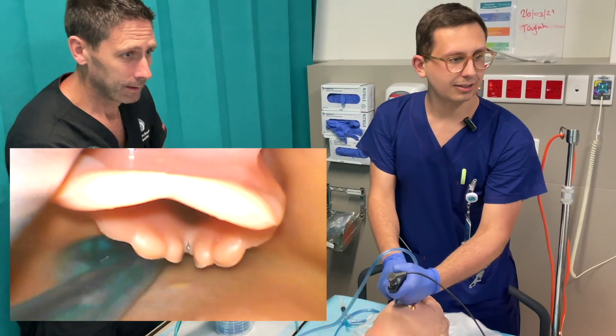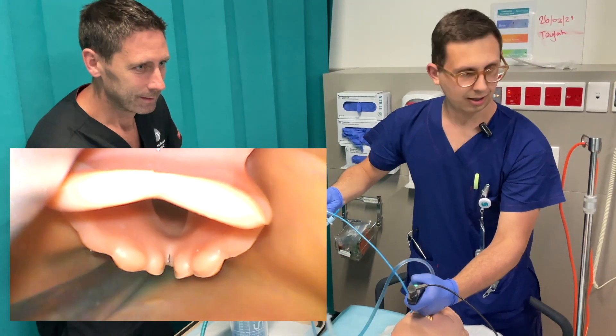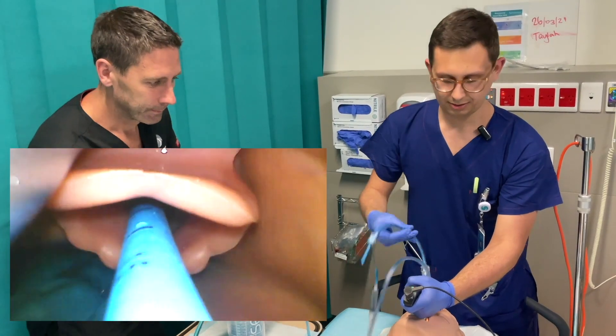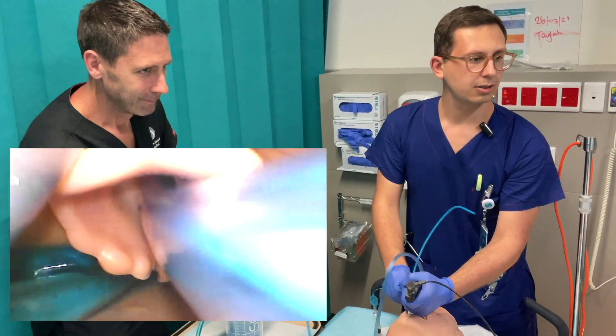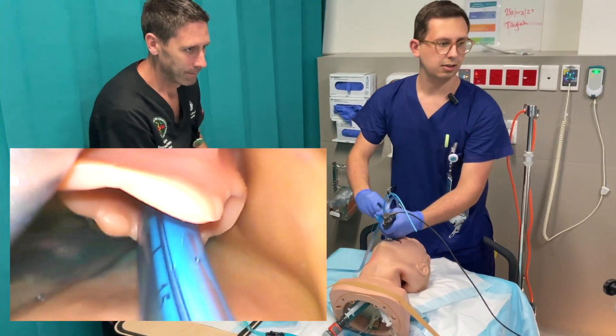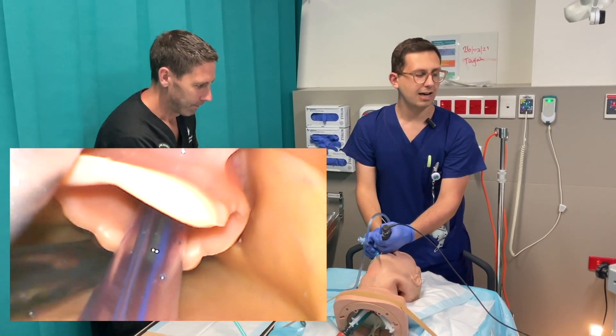Which means I'm transferring the laryngoscope to the left. I have a good view. I pop in the bougie. Pop in the tube. Inflating it. Taking out the bougie. And now our airway is secured.